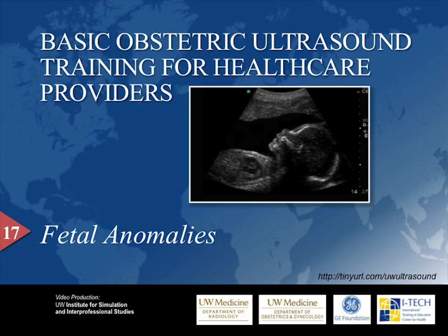My name is Dr. Christina Adams Waldorf, and I will be narrating this 17th video in our Pregnancy Ultrasound series. This video will focus on fetal anomalies, also called birth defects. Please visit our website for access to all of our video and training materials.